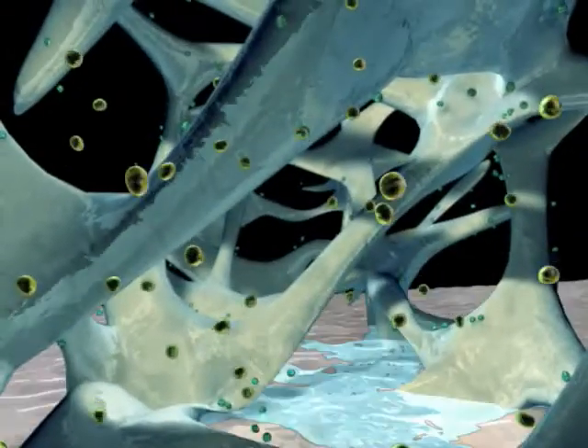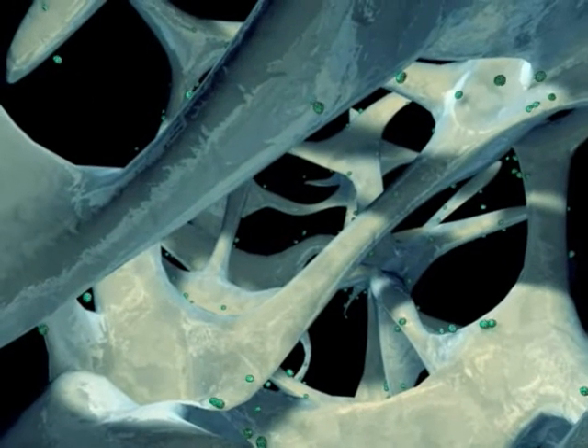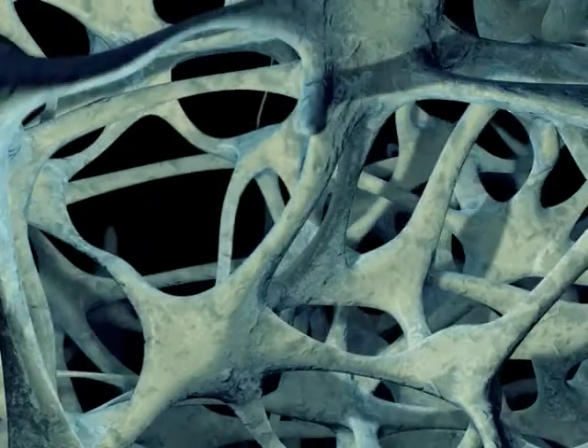An intensive decontamination, disinfection, and cleaning regimen is applied to the tissue to remove and inactivate viruses, bacteria, and fungi. Processing residuals are then removed.